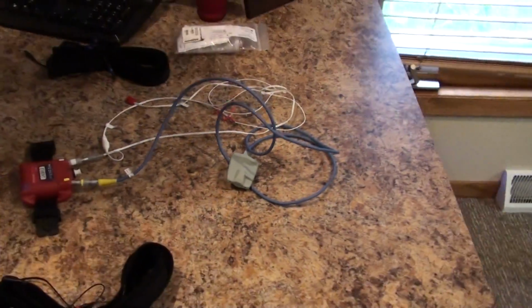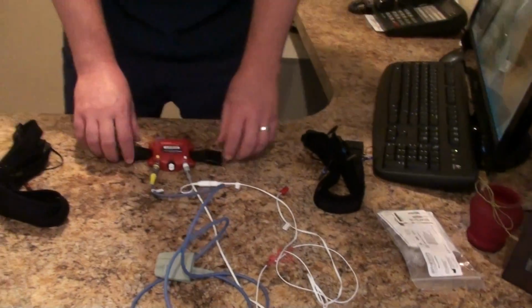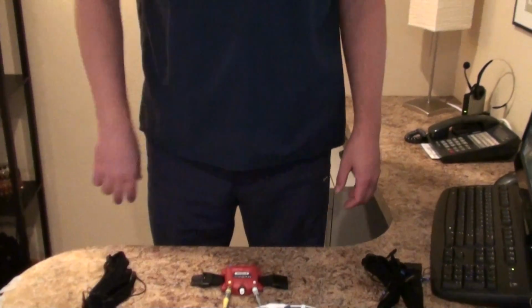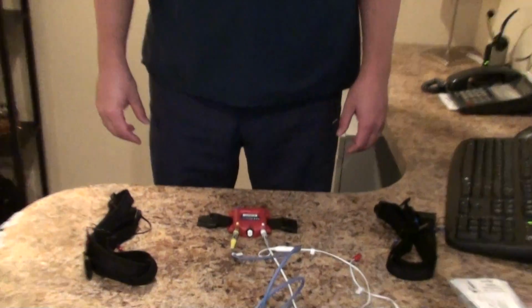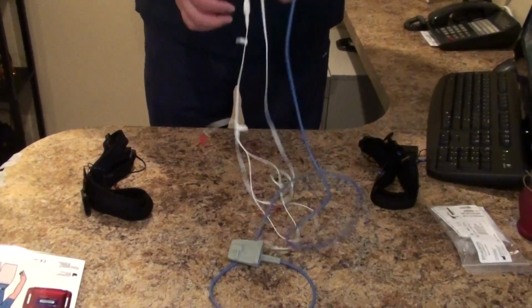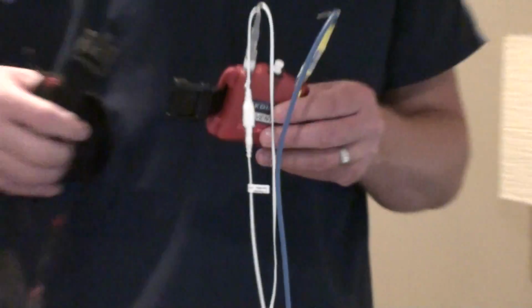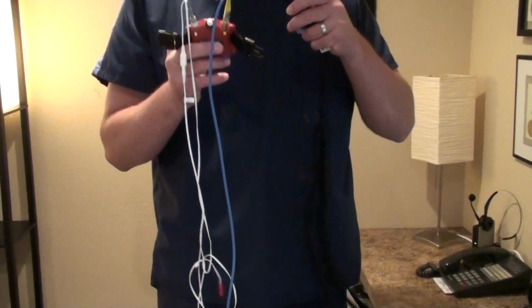First of all, we will start with hooking up the chest and abdominal effort belts. These belts hold the MediByte recorder in place and record respiratory effort. Make sure the MediByte is upright and facing away from you. Take the belt marked with the red tape first and clip it on the left MediByte clip.